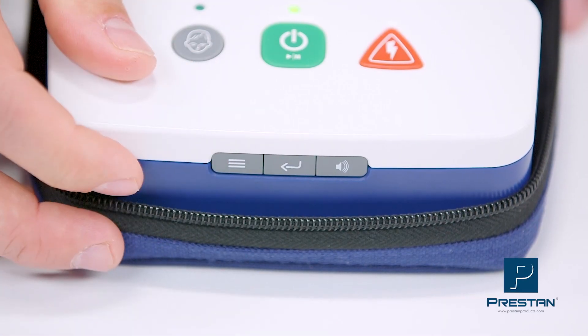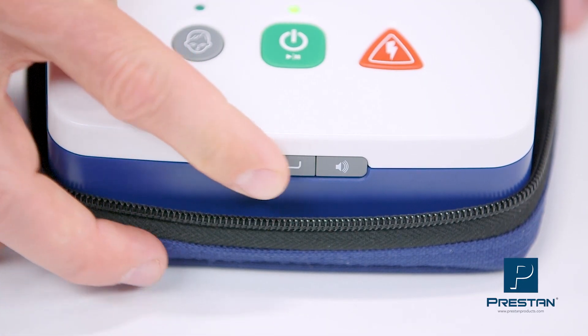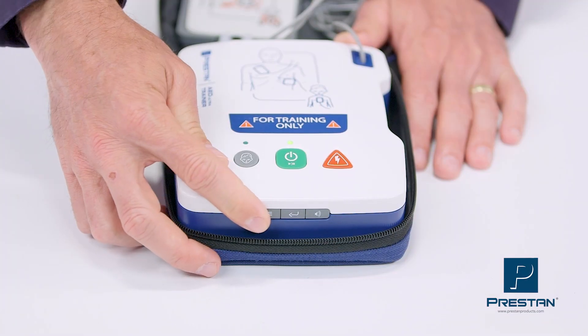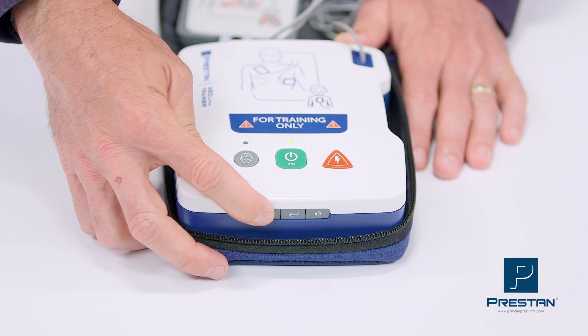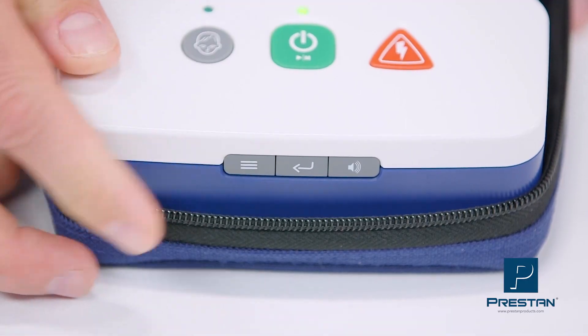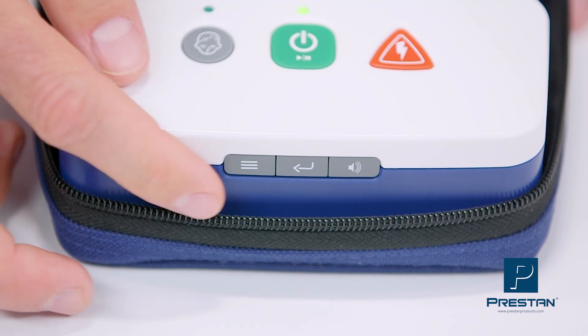The easy-to-use audio menu allows you to customize your training with options of automatic or semi-automatic shock, five training scenarios — including shock sequences — and the ability to turn on or off the compression metronome and ventilation command.